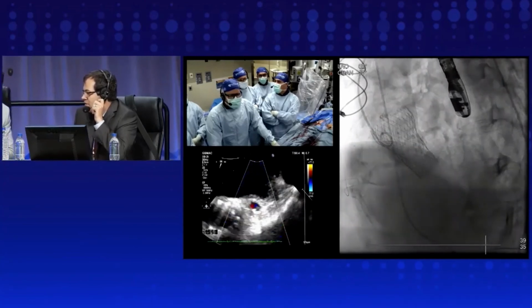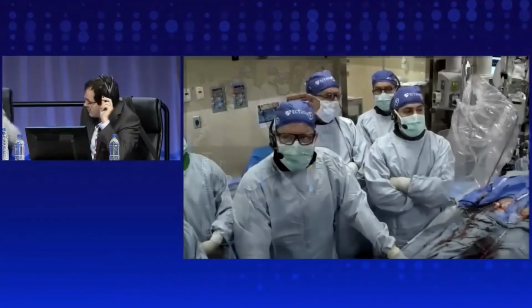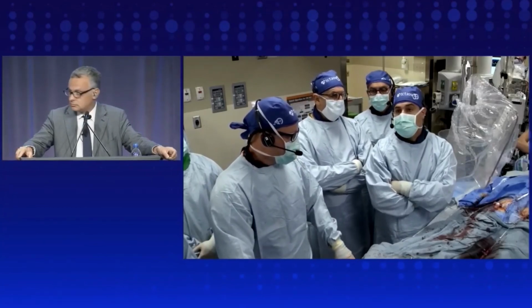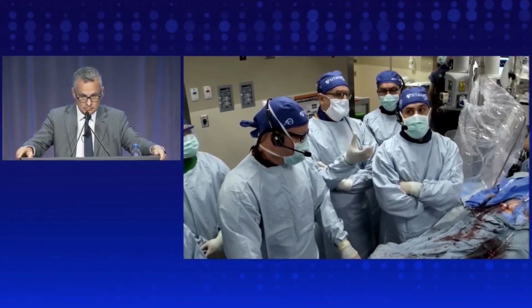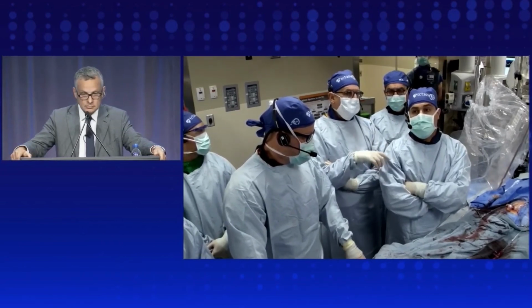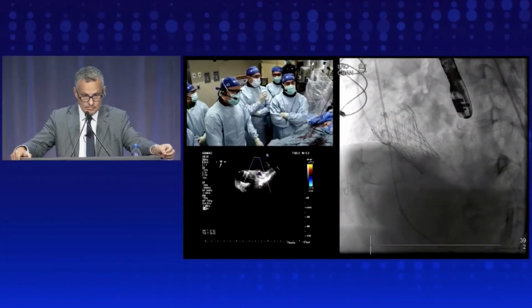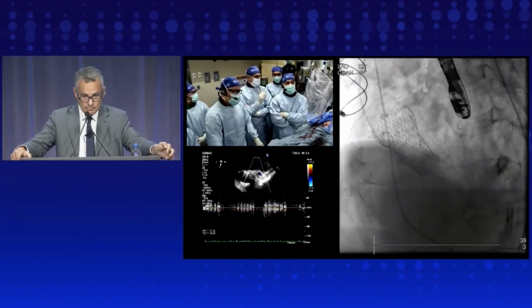And I think there's a lot to learn, but a beautiful procedure, guys. A lot to know. No, I would say a couple of things. There's still some technique issues that I think could be better understood. Even when we set up for this case, one of our concerns was the snaring of the wire, how long that will take, and just basically being able to manipulate the snare a little bit better in the LVOT. In terms of the guidance in the cusp, I think we've gotten quite good with the Amplatz guides and sizing them. And the piggyback and the IM, but again, there may be some more nuances to make it an even safer and quicker procedure.